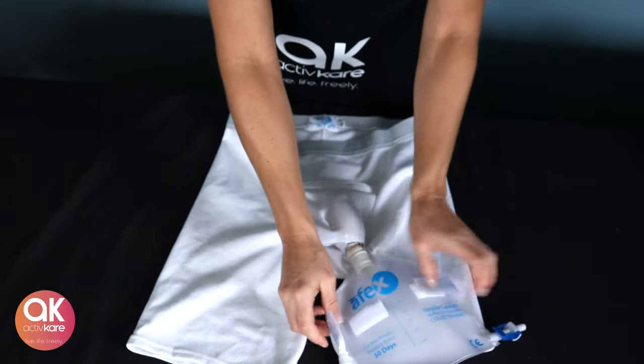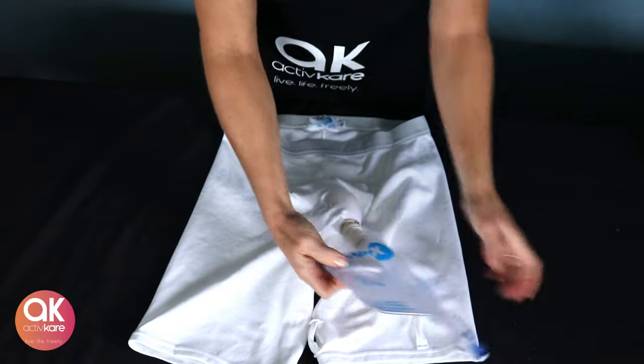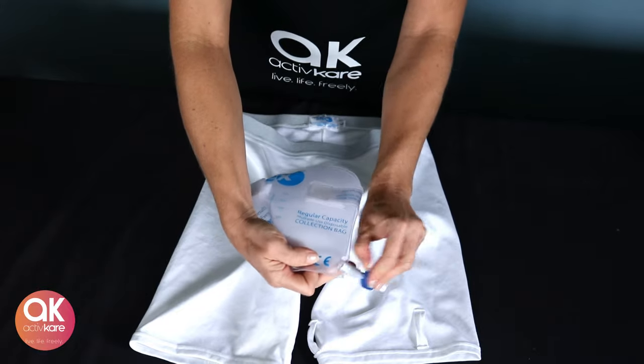Remove the velcro tabs to empty the bag while wearing — easy open and close valve. Repeat the process at the end of the day for cleaning.